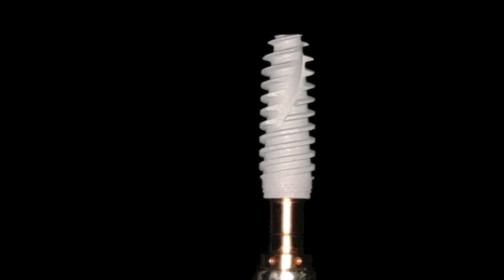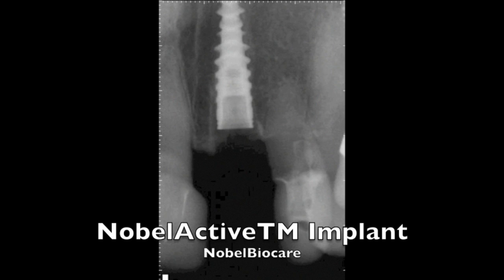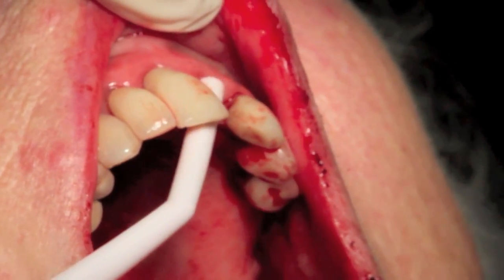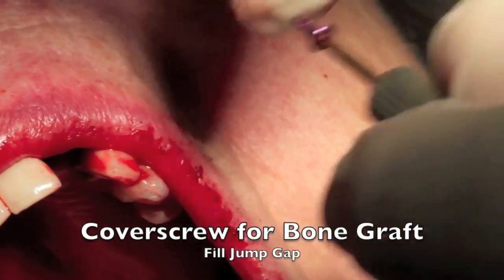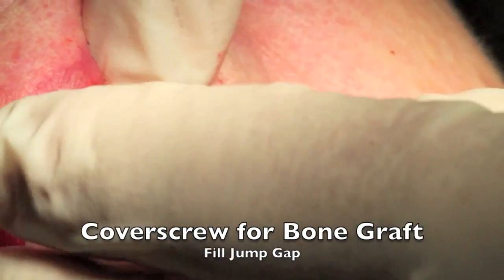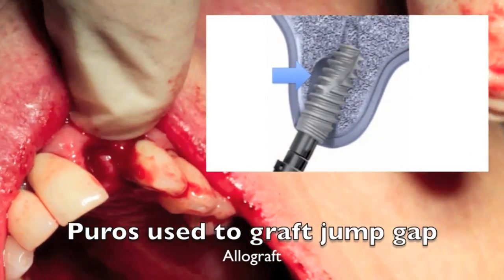So we have this 3.5mm implant in. Now it's important to make sure that we have this at the right level. So, we see the X-ray, it's looking good. I will either put the cover screw or the immediate temporary abutment on prior to bone grafting, because what we're going to be doing is a buccal graft into the jump gap.